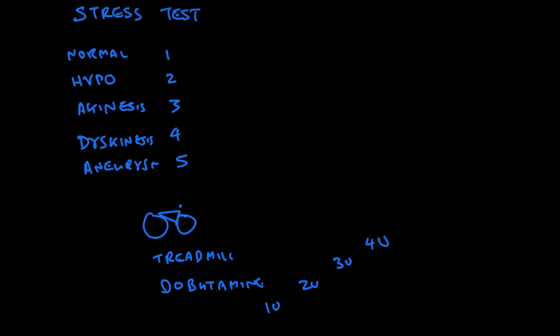until the patient reaches a target heart rate, or if there are wall motion abnormalities. So you stop with reaching the target heart rate or with wall motion abnormalities, or if the patient has symptoms, of course, where they need to stop. But once you reach the heart rate, unlike a treadmill EKG test, there is a clear distinction. There you keep going even past the target heart rate. Here you would stop based on the target heart rate.